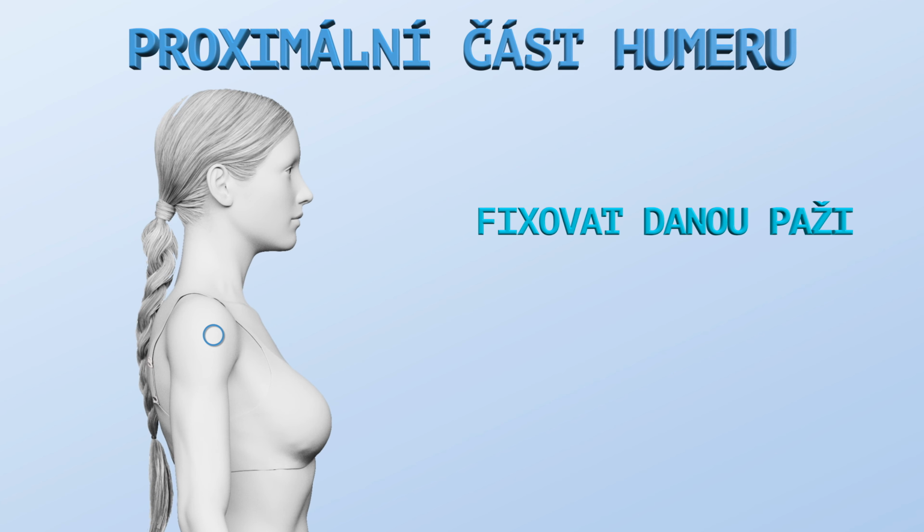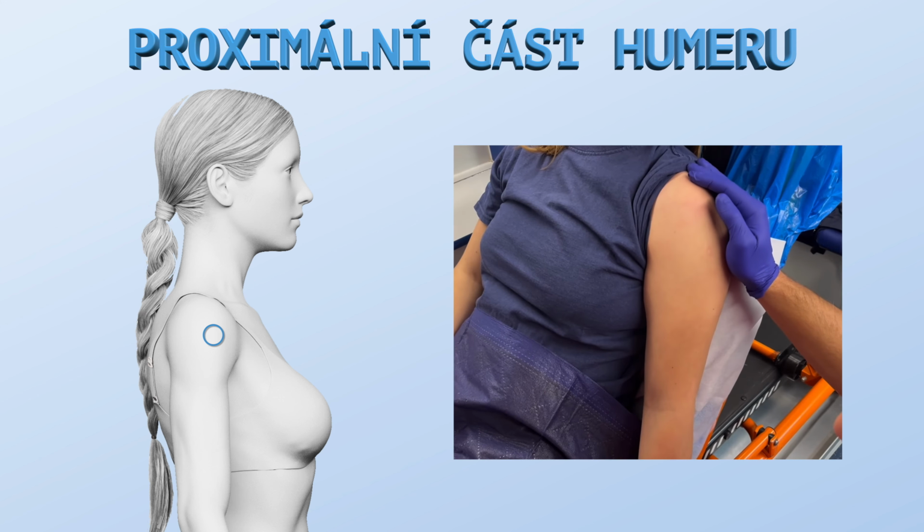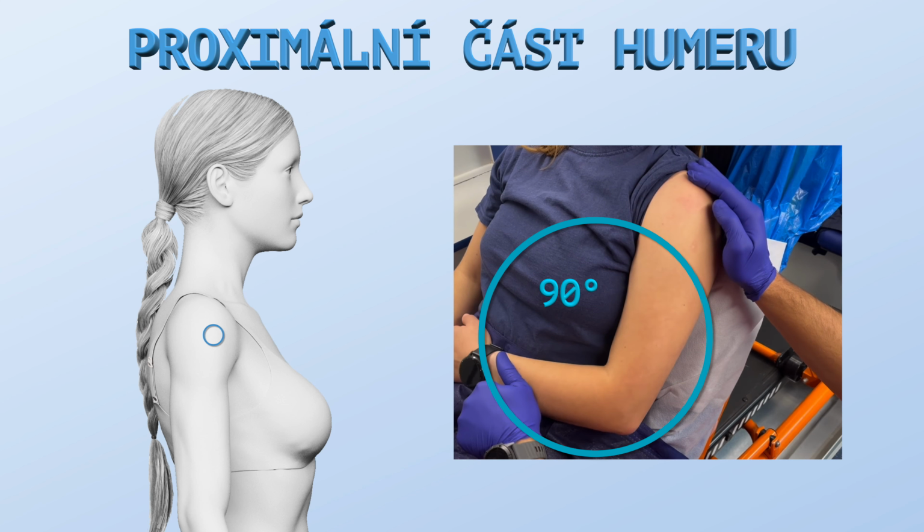First, the arm must be stabilized to prevent unintended movement, in pronation with the palm down and elbow flexed to 90 degrees. The correct insertion site can be identified using two hands. One is placed with the ulnar edge at the junction of the deltoid and pectoral muscles, the other on the center of the deltoid where the shirt seam runs.